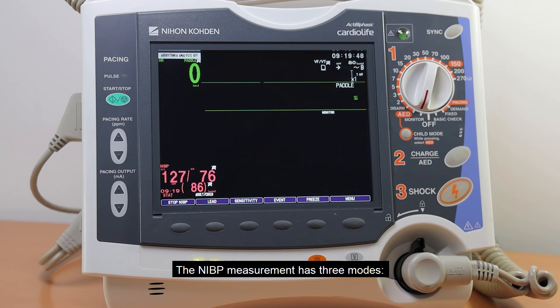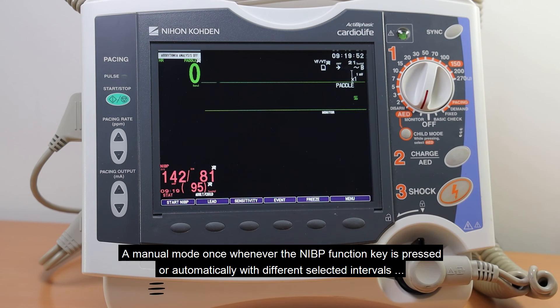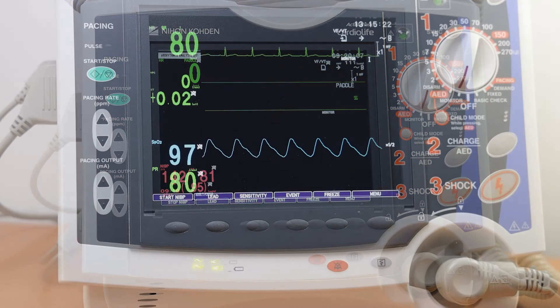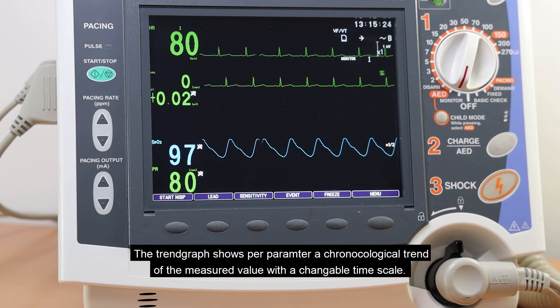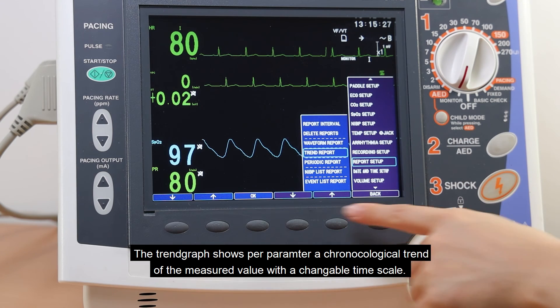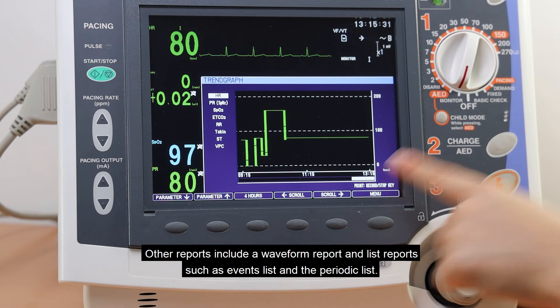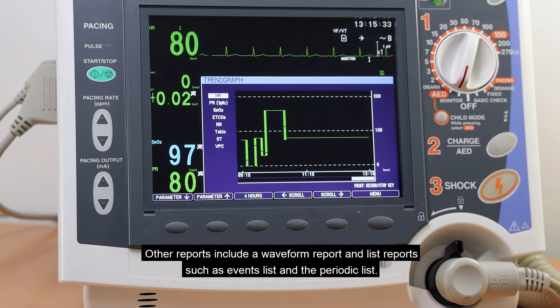The NIBP measurement has three modes: a manual mode triggered whenever the NIBP function key is pressed, an automatic mode with different selectable intervals, and a STAT mode for monitoring NIBP — for instance during general anesthesia — with a selectable STAT program. The trend graph shows a chronological trend of measured values per parameter with a changeable timescale. Other reports include a waveform report and list reports such as the event list and the periodic list.